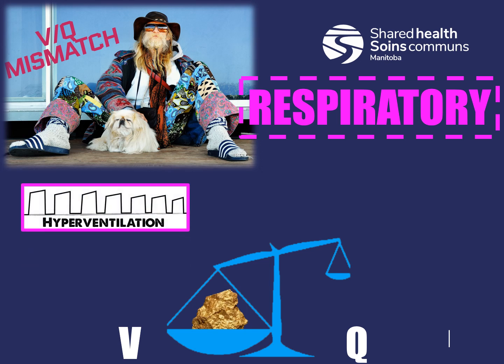Hyperventilation is increased respirations, which lead to increased exhaled CO2, which leads to low end tidal CO2. The waveform begins to shorten due to the increased respiratory rate and shorter exhalations. Decreased amplitude is due to the excess exhalation of CO2, and this is an increase in respiratory rate and an increase in tidal volume.